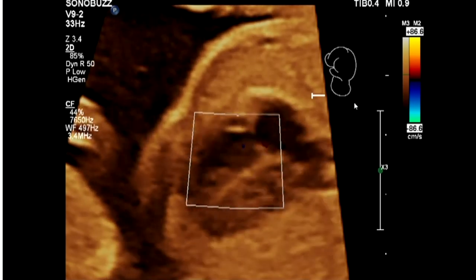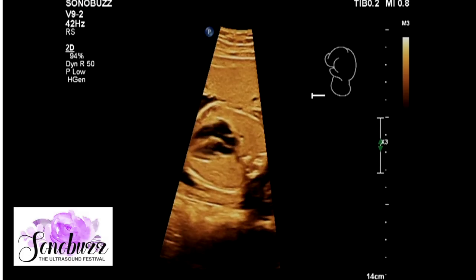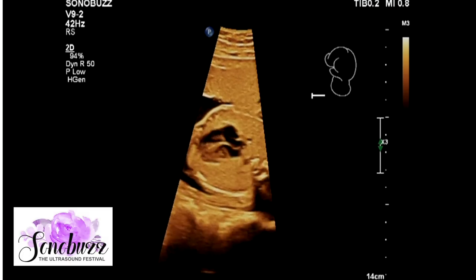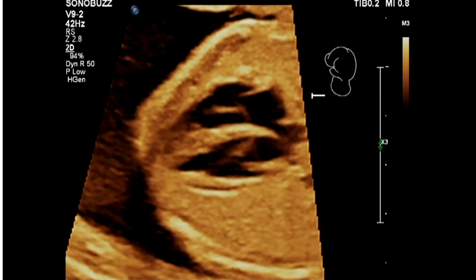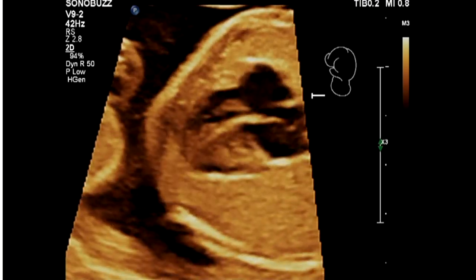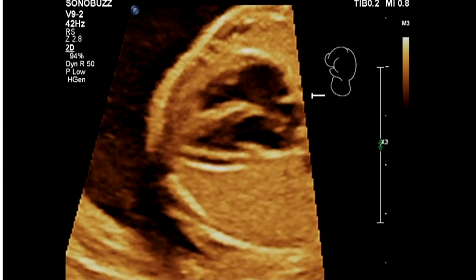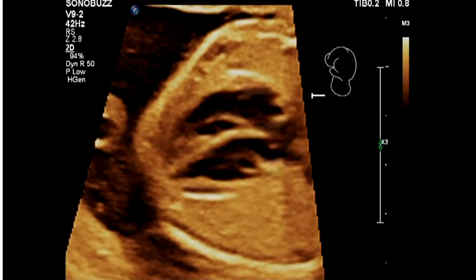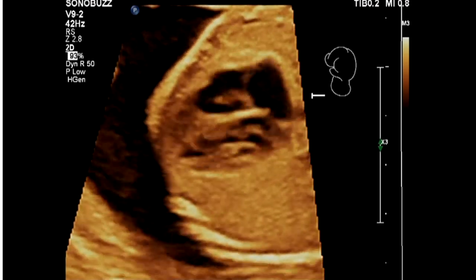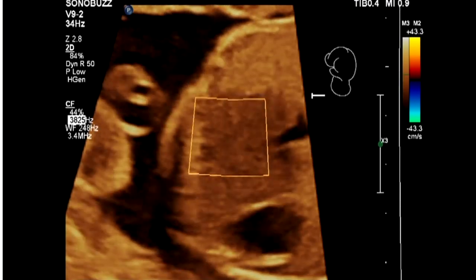Backing out a little bit — we looked at the mitral and tricuspid valves. Now let's look at a pulmonary vein. Going in terms of structures rather than views — this is not a single four-chamber view, but you want to put color on. This is very important: looking at the inlet septum you can see there's no dropout. The mitral valve inserts up here, the tricuspid valve a little further towards the apex, and here we're relatively perpendicular.